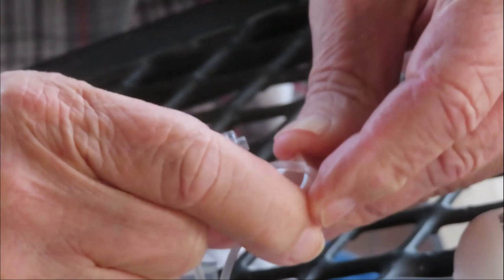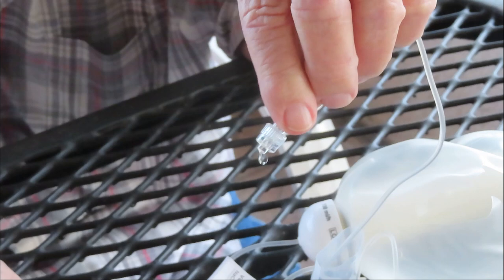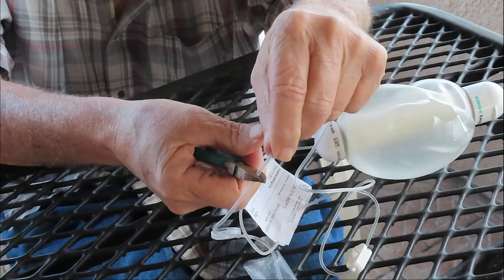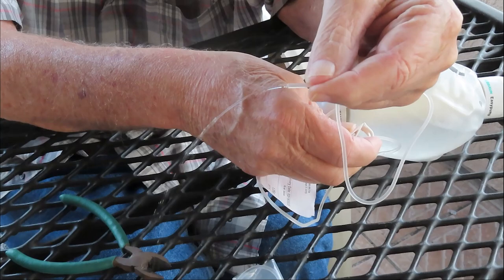As soon as you do that, the liquid should start coming out. As you can see, there's your flow, the drip. I'm on my outside porch to do this, by the way. So there's your drip. Now what we're going to do, we're going to go to this flow gauge right here. I don't know how much comes out or not, but we're going to cut this. And it probably would be a nice stream. Yeah, there you are. There's the flow gauge. As you can see, it's got a nice little stream that comes out.